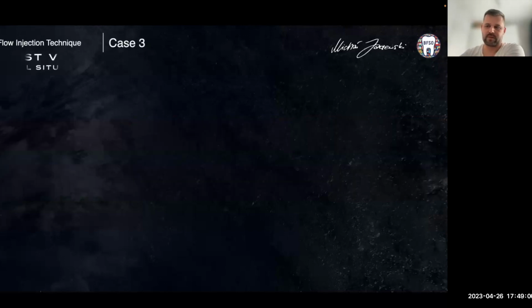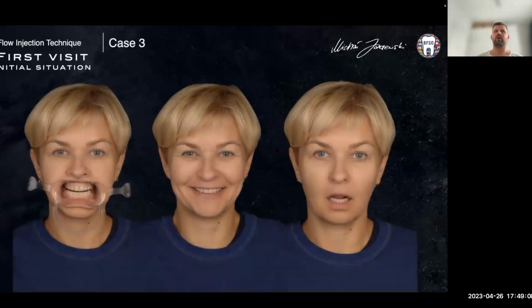So, of course, I would like to show you how it looks in my practice. I will show you a case when the patient comes to my office, and during 2 visits, we start everything. On the first visit, of course, there are pictures of the initial situation. We also make the medical and dental interview.